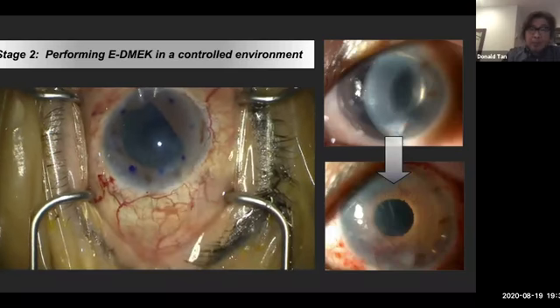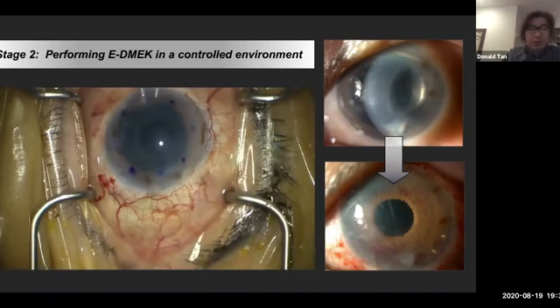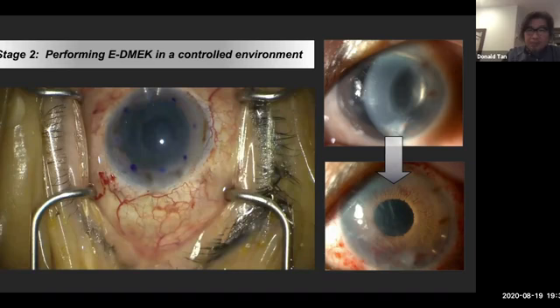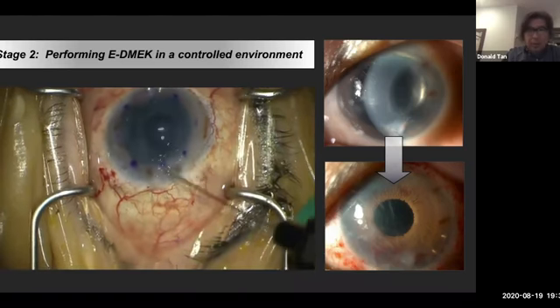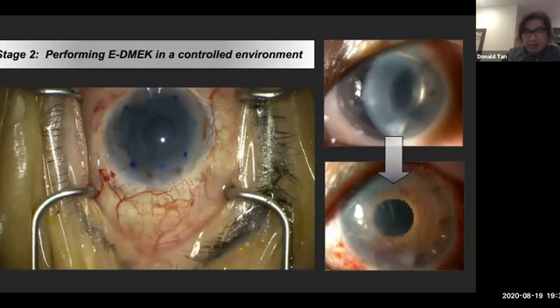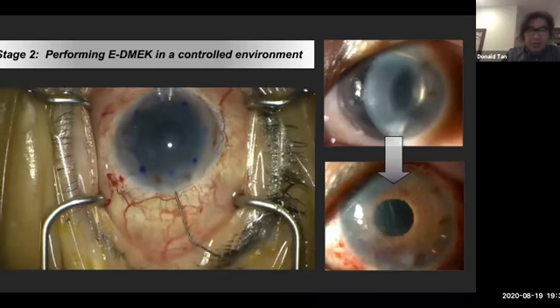And it's important it won't collapse, because this is silicone as well, you don't really want the endothelium directly plastered to the artificial iris. And I haven't encountered that so far. And really then that's quite easy now. So it's a pretty standard DMEK now.